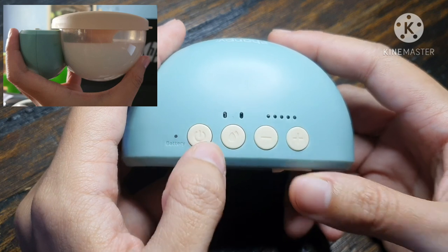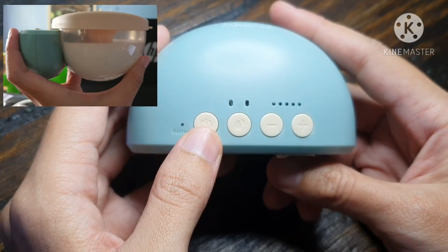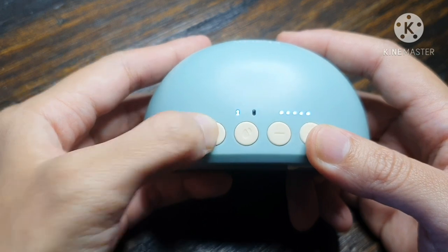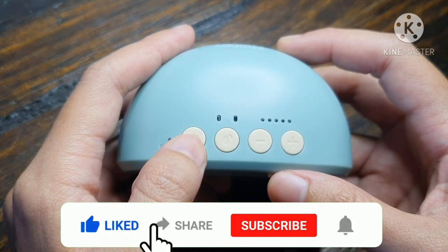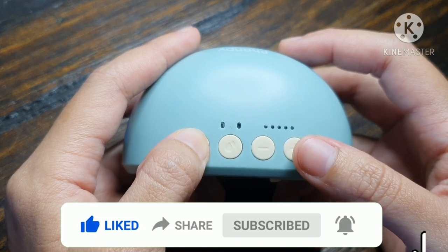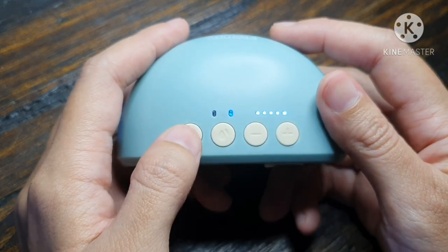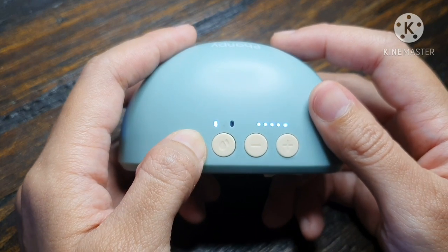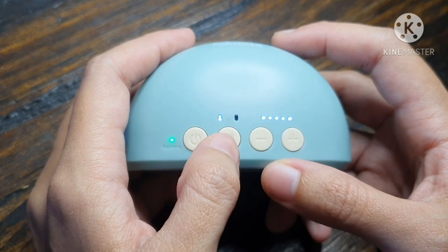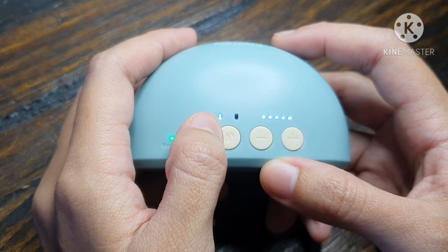Ang kinagandahan pa nito — huwag ninyong i-on yung motor kapag naka-charge siya. Nakadesign talaga itong motor unit na hindi siya pwedeng ma-on while charging. Isa pang advantage ni FUNPY, may memory function siya. Pero kakaiba yung memory function niya — sample, kung naka-expression mode tayo tapos tinurn off natin, pag tinurn on natin ulit, nasa stimulation mode siya. Pero level 5 pa rin, kasi yun ang last natin.